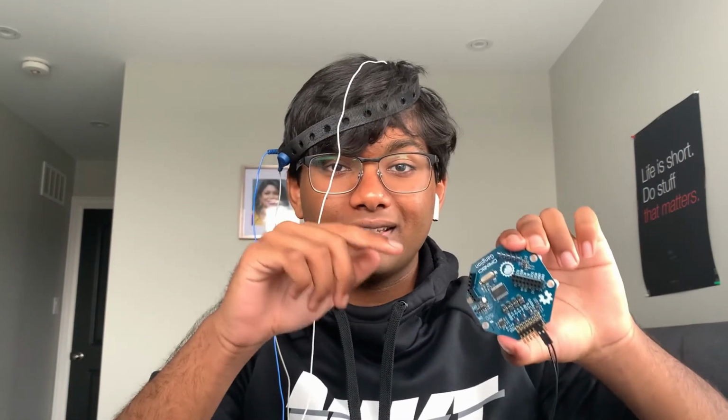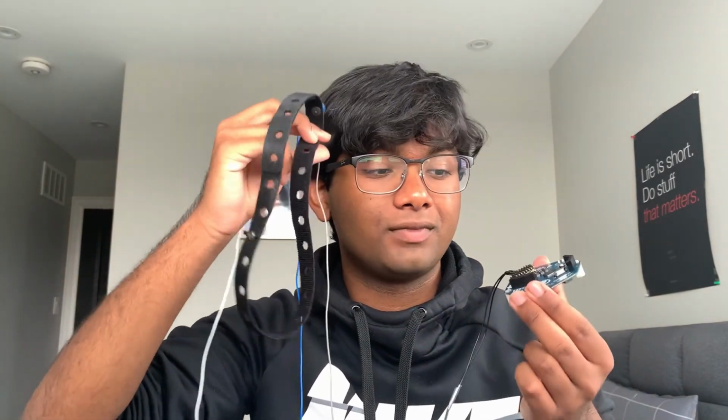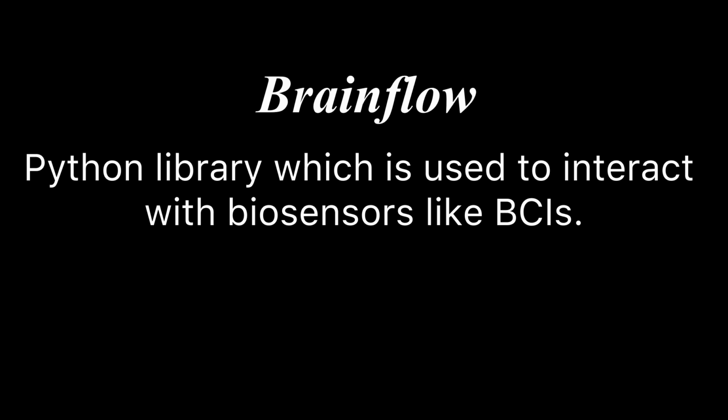2 hours later. And would you look at that, I have the OpenBCI Ganglion on board, which is, well, a BCI, along with all the headwear that I'll ever need for this entire project. So this gets the data from my head, and this actually processes the data, but now I actually need to send it to my computer, which requires code. The code's fairly simple if you already know Python. It's mainly a walk in the park, especially with how easy BrainFlow is and how nice the documentation can be.